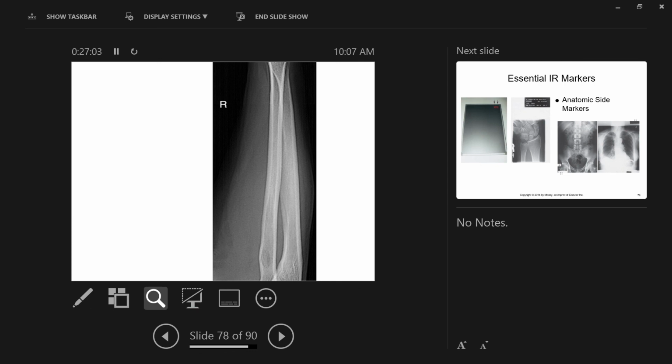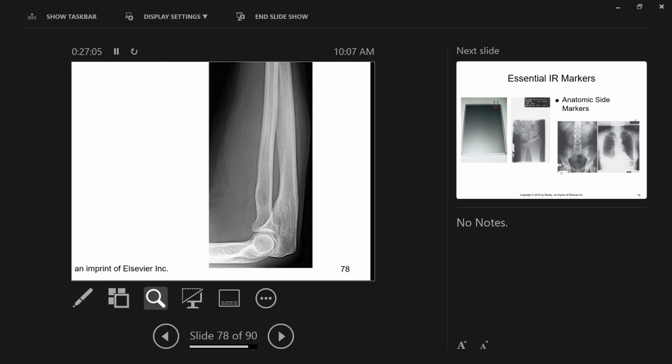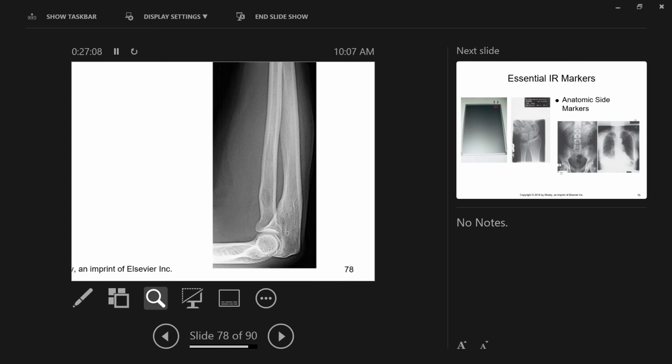And then within the bone, shown better at either ends of the extremity, is this sort of patterning to the bone here. Okay, so bone is not just white, right? Bone doesn't show white on X-ray. It's shown in different shades. This is called trabecular markings, or trabecular pattern, or trabeculae. When you crack a bone, look into bone, you get to see this sort of spongy pattern in the bone. Okay, that's what's seen on X-ray.